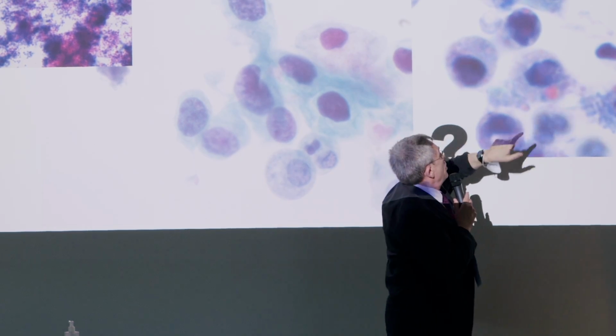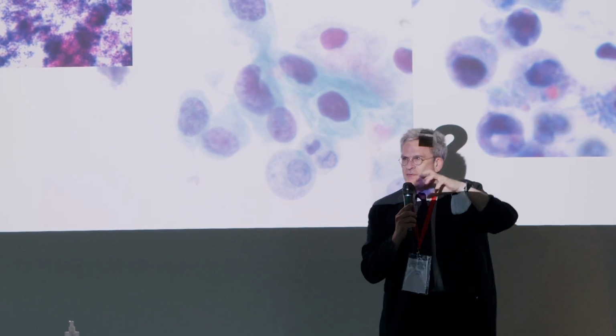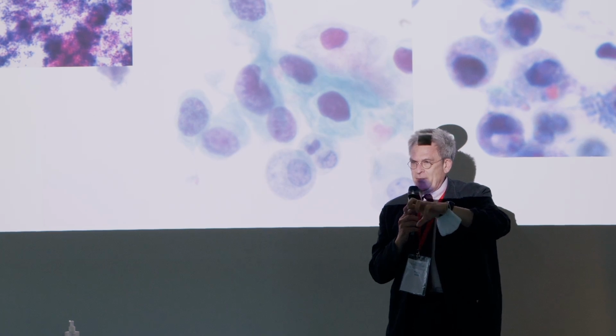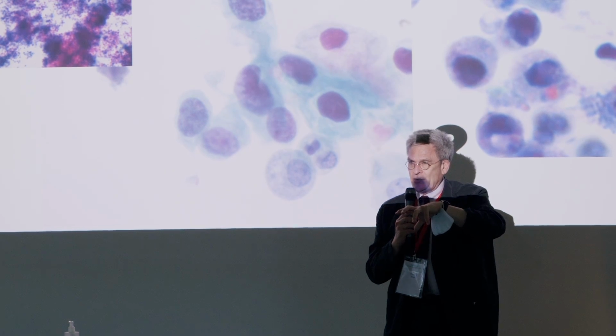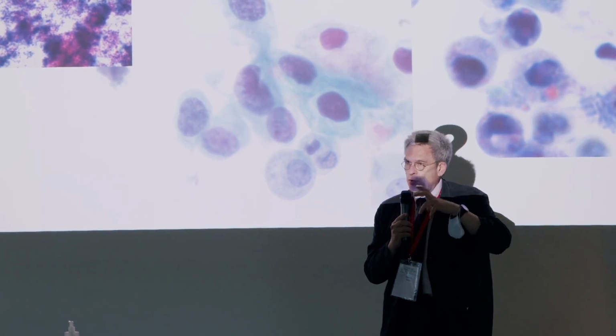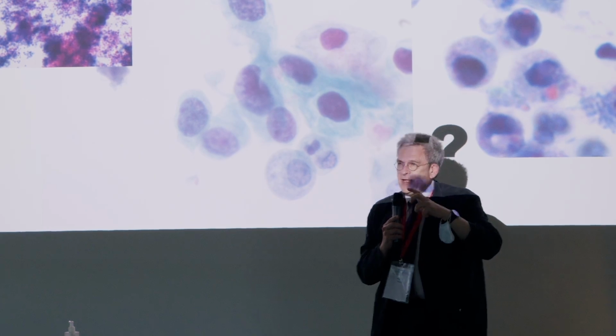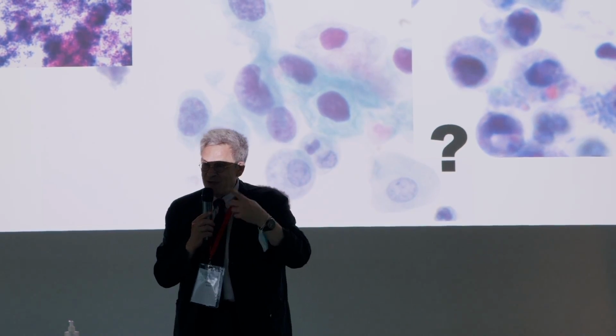at least the most worrisome. So, you know, there are some phagocytic elements, probably including red blood cells inside. And so I wouldn't think about a mucinous component, because then it is not very coherent with the rest.